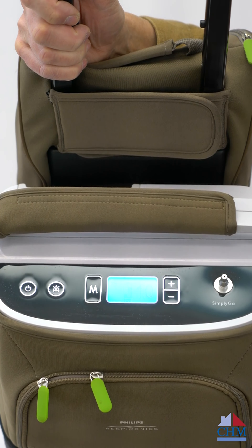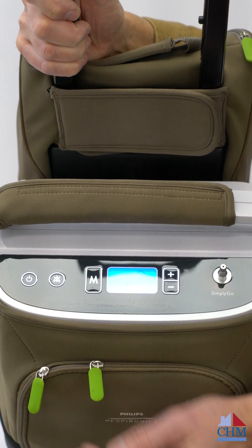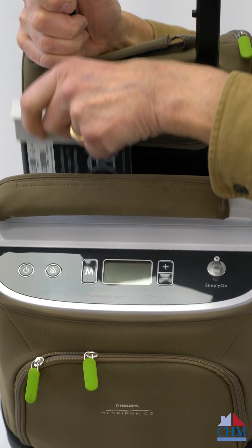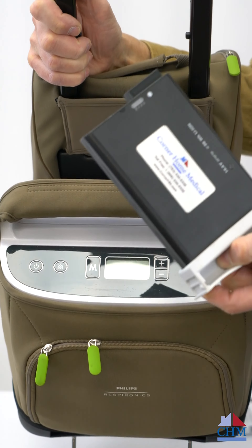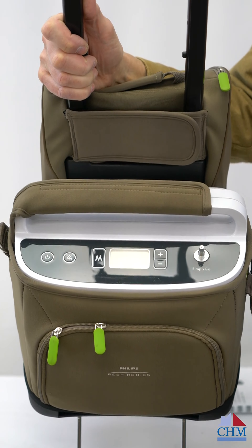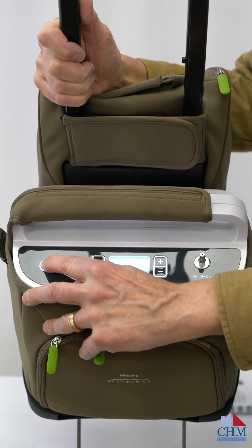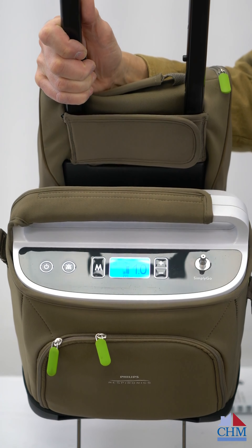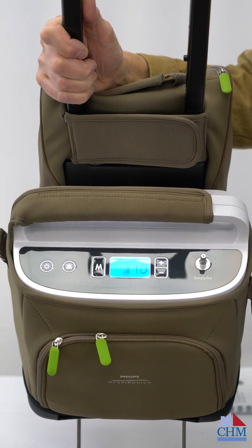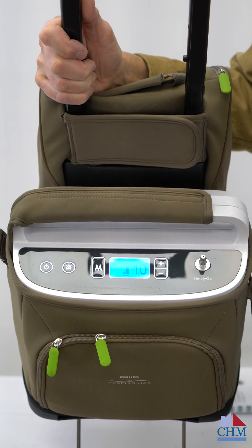Battery time on this unit is not very long. The battery is small, so we don't have a lot of battery power — it doesn't last too long. We've got about 0.7 hours running at two liters per minute, or about an hour and a half at one liter per minute. In the pulsing modes, that saves battery time, so depending on the setting, we could have up to about four hours in pulsing mode.